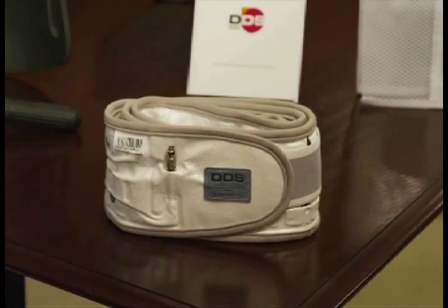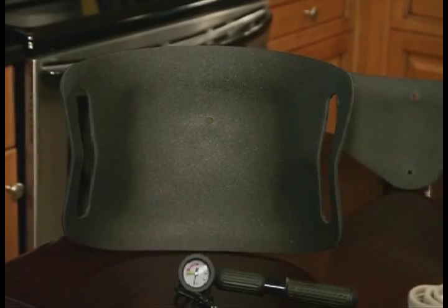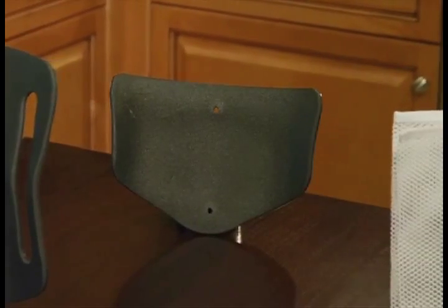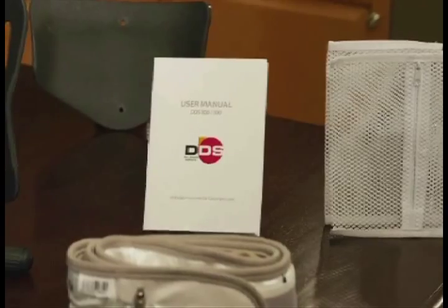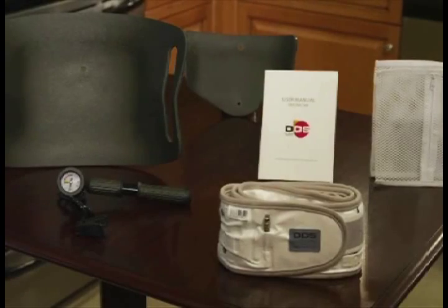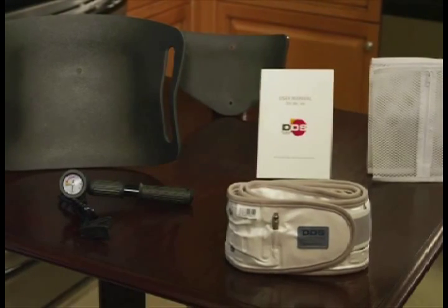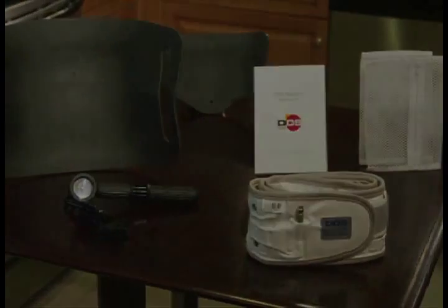In your box, you will find your lightweight DDS Belt, your easy to use hand air pump, a back panel, a front panel, a reusable mesh laundry bag, and your easy to read user manual. To get started, place all items from your box on an easy to reach surface, such as your kitchen table or counter.